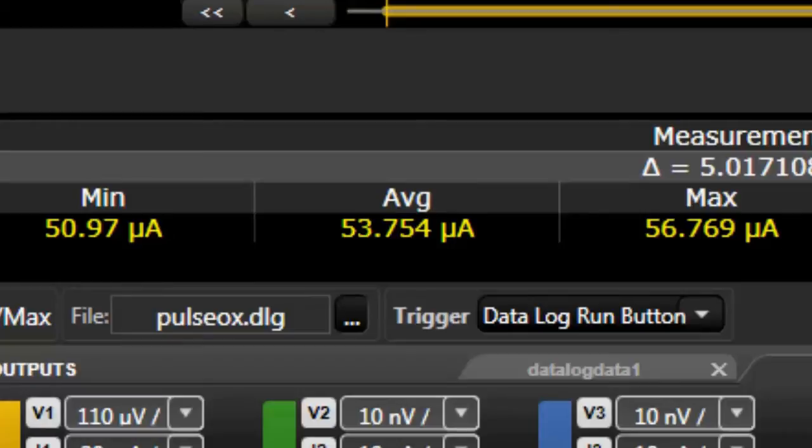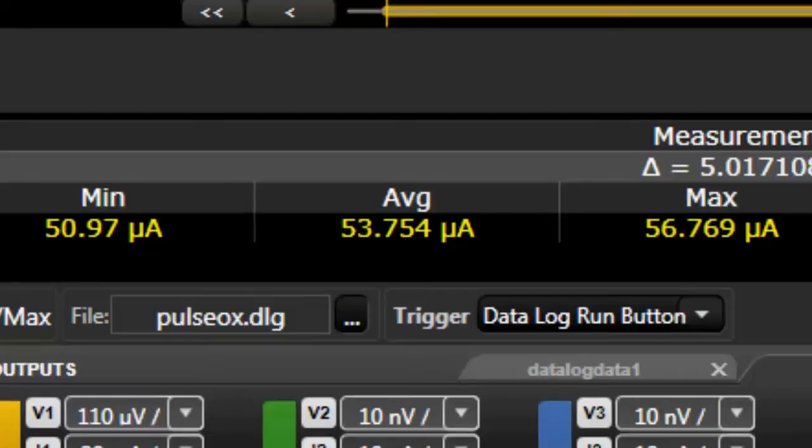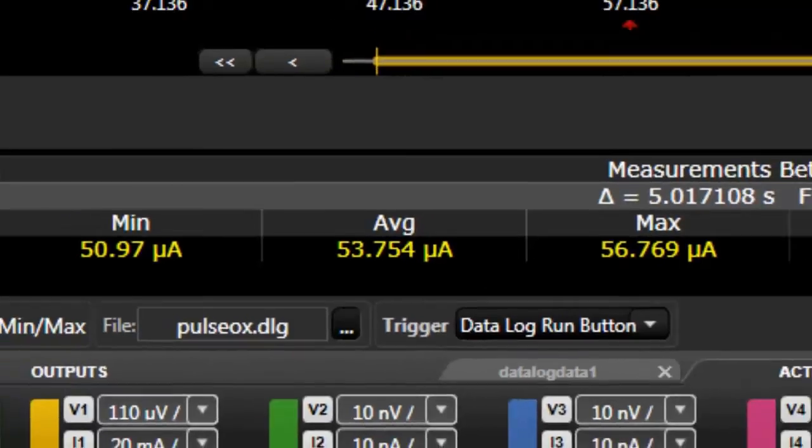So we've got considerably less sleep current. This level of accurate measurement is not available with a standard technique. It's the seamless ranging that allows you to both measure that peak at 570 milliamps and this sleep current down at 53 microamps.